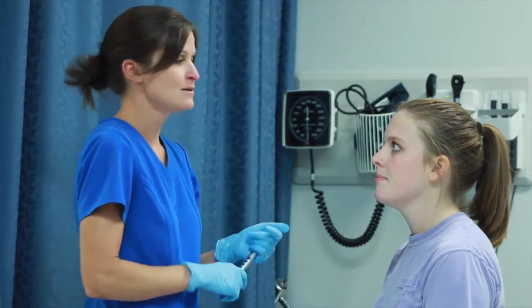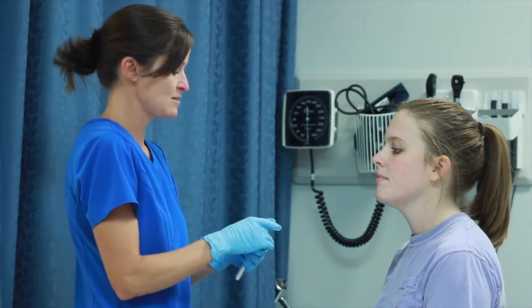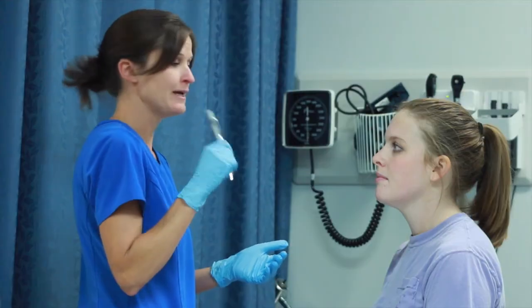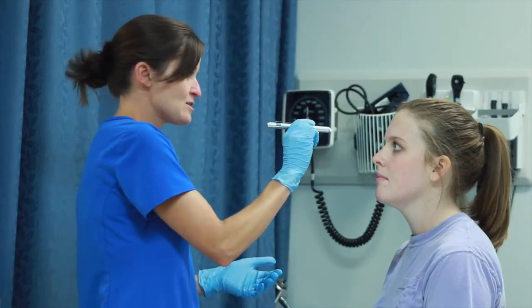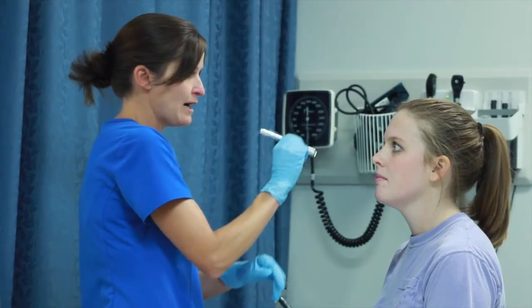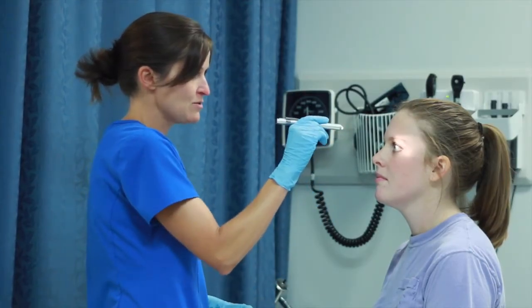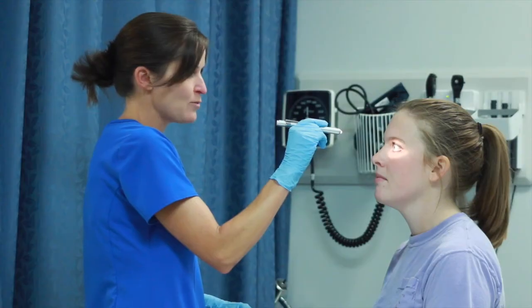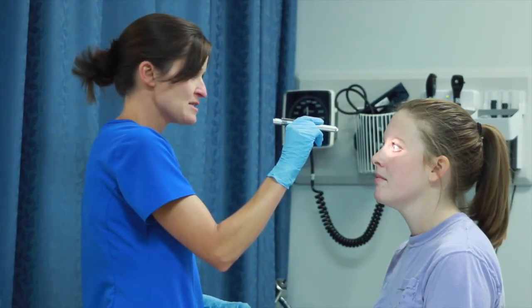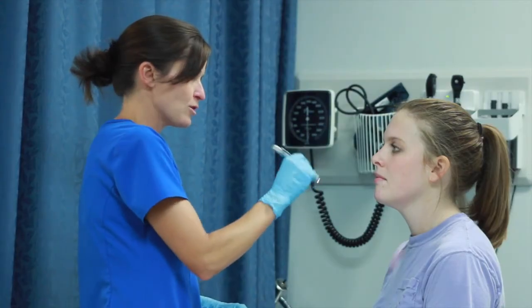Now we can test visual acuity. The first test is the corneal light reflex. Using your pen light, shine it straight into the pupil and you should see that reflection in the same place on both eyes. This tests muscle function. If the light is not symmetrical or doesn't shine in the same place, it could indicate paralysis in one or both eyes.